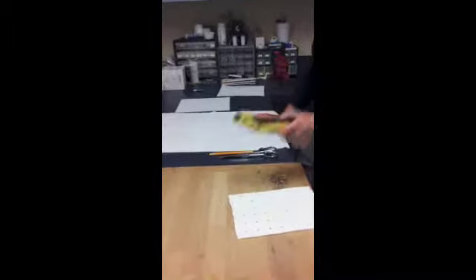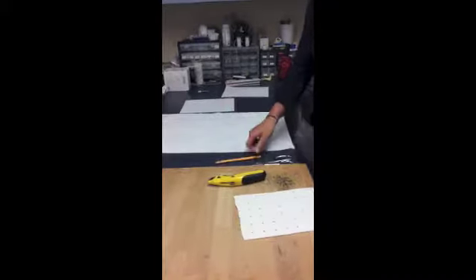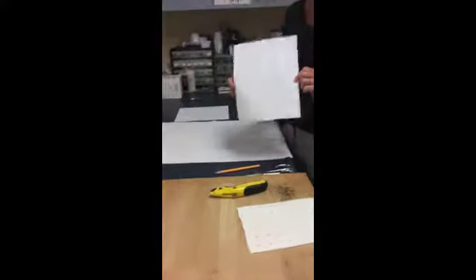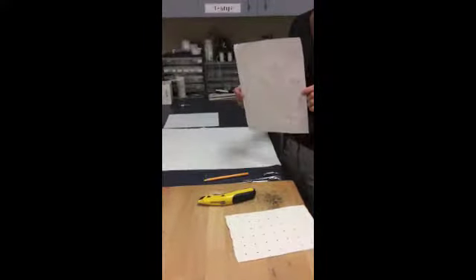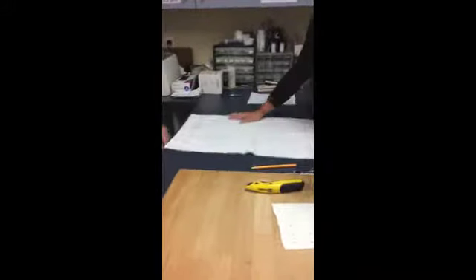The materials needed are thermoplastic material — this one's already cut for me — a knife to cut if you have a bigger piece, scissors, something to draw with, and then you can have a pattern that's already laid out for you, or you can make a pattern on the patient if their arm's a little bit smaller.